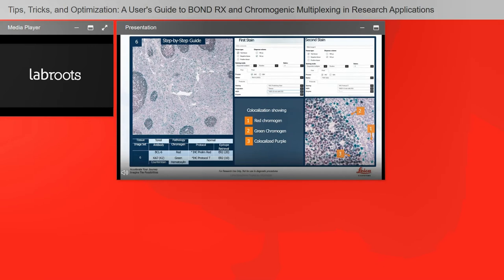Finally, this is an example of how the red and green chromogens can produce a co-localized purple. We have a piece of tonsil staining with BCL-6 and Ki-67 with hematoxylin counterstain. Cell number one shows the red chromogen — that's BCL-6 — and number two shows the green chromogen — Ki-67 — marking cells undergoing proliferation. With the two markers you get the co-localized purple in region three.